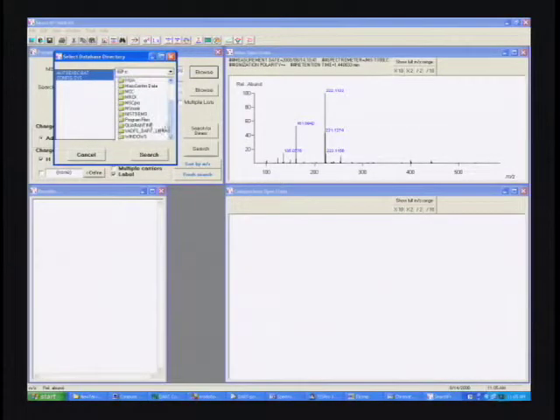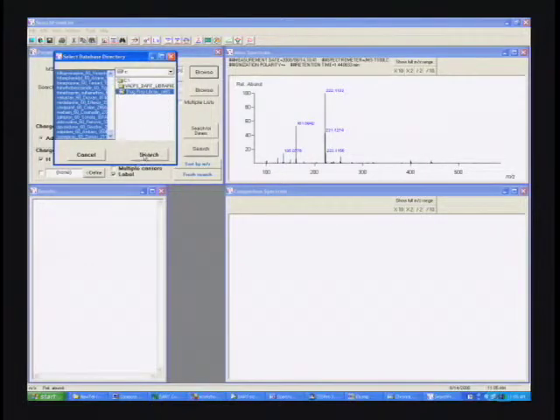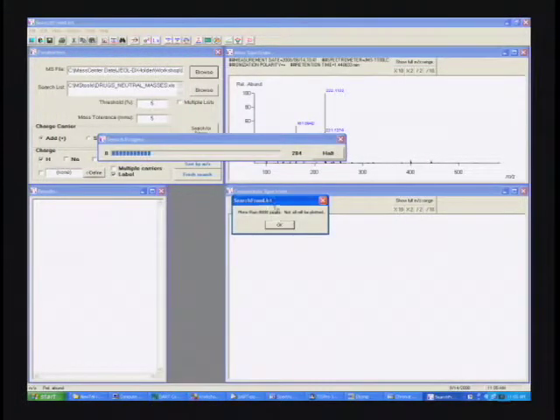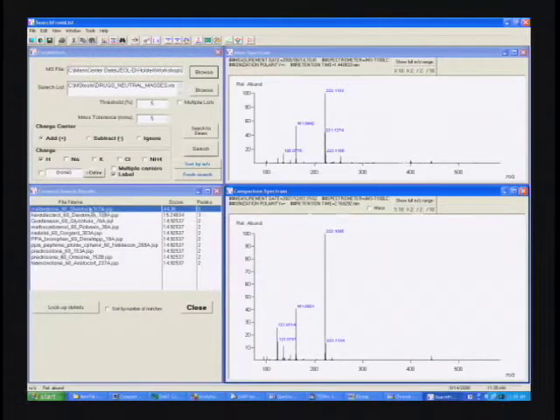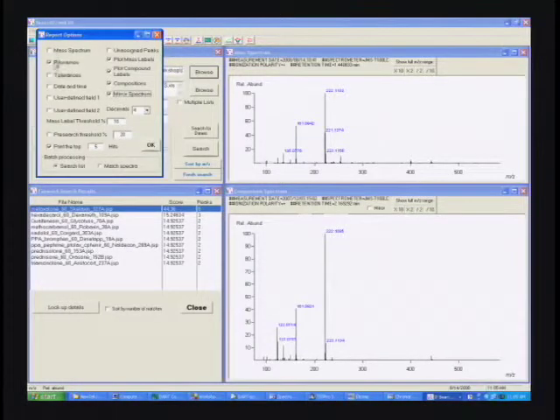In this case I'm not sure we have, but we'll search the library spectrum one more time, and we're going to search the 60 volt preparation library. And we'll see what we get for a hit here. We'll find our top hit is metaxalone. And once again, let me pull up the mirror spectrum so you can see that.